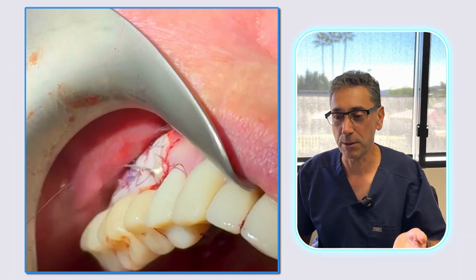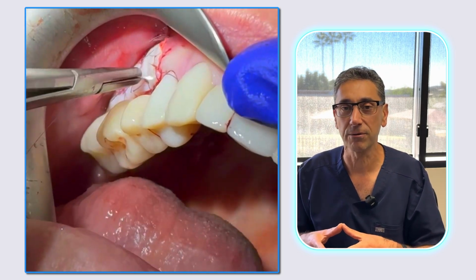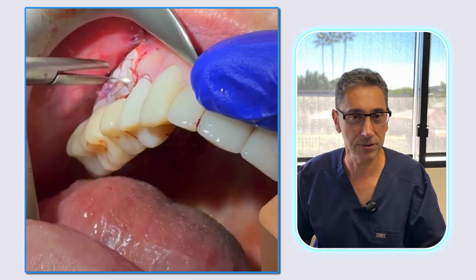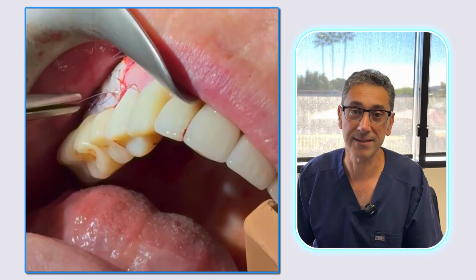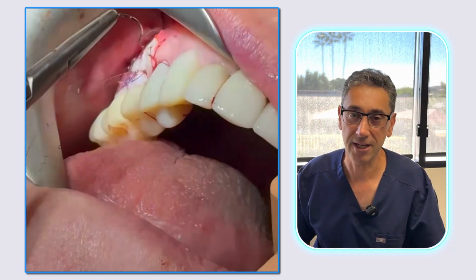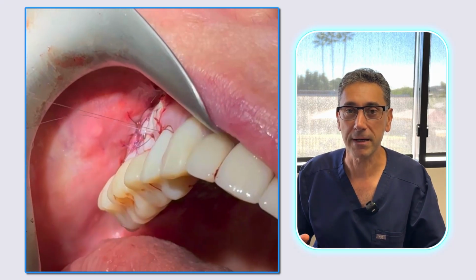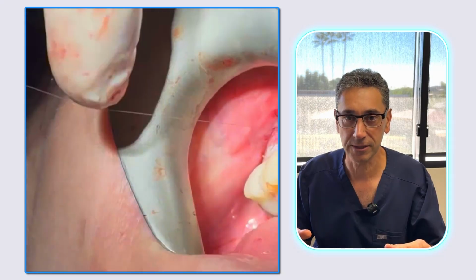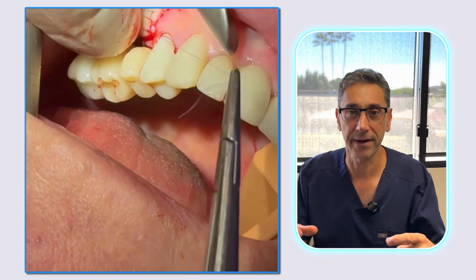The suturing is very important because we have to make sure the graft is 100% secure to the recipient side. I usually start with a very small thread called 7.0 PGA. You have to use magnification for it, but it gives us good stability of the tissue. I use it on the four corners of the tissue to make sure it is securely positioned in the proper area.